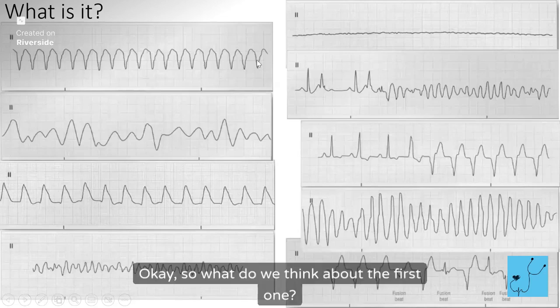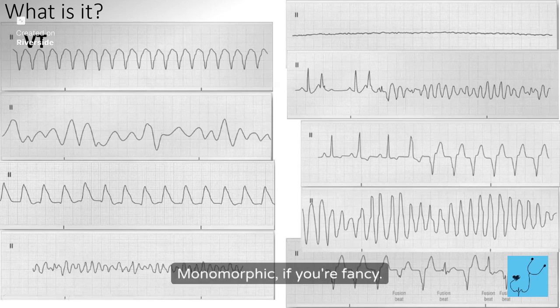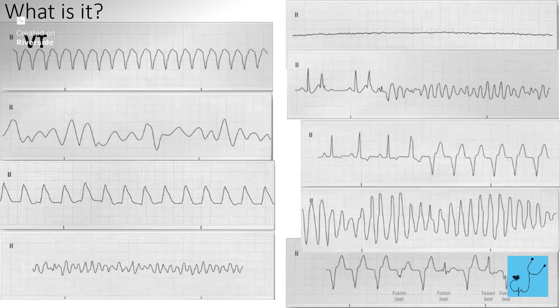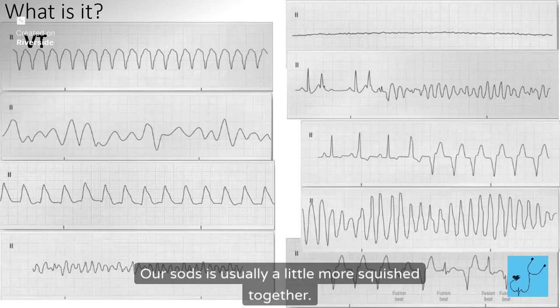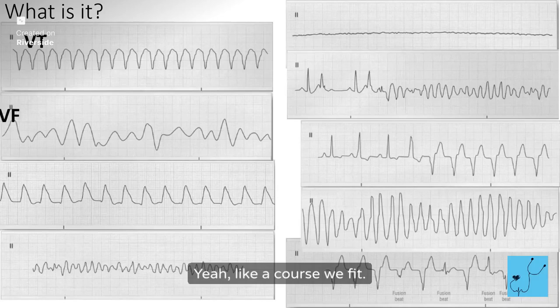Okay, so what do we think about the first one? VTAC, right? Monomorphic if you're fancy. What about this one? Torsades is usually a little more squished together. Yeah, like a coarse VFib. Coarse VFib, yeah.